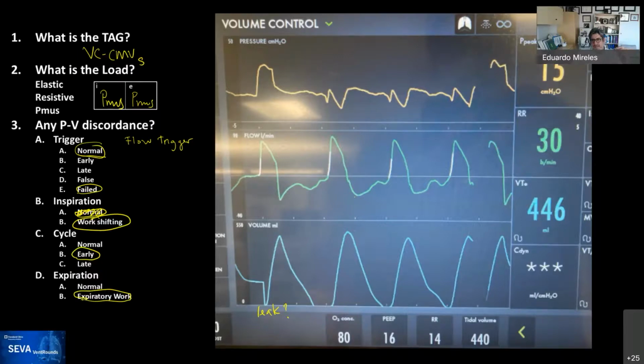No. I mean, the work shifting is like, if I am gonna have the patient do all this work, then I like having pressure support. But obviously, looking at PEEP and the FiO2, it looks like he's not ready, so I need to relax him or knock him out, basically. One thing that you can think of is PAV with servo, but my expectation is it's going to get higher volumes than what we want. So maybe we're at safety at this point. We're trying to limit tidal volumes. I'd rather try and abate the patient's respiratory drive.